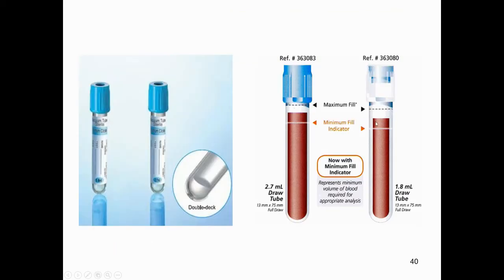The tube should be filled to the maximum, with the exact ratio. If the vacuum draws and you see that the blood does not reach the minimum fill line, the ratio is altered because there is more anticoagulant than blood sample. So it should go past the minimum fill line indicator. If a tube does not vacuum properly or the flow does not reach the line, we need to instruct the medtech to collect again.